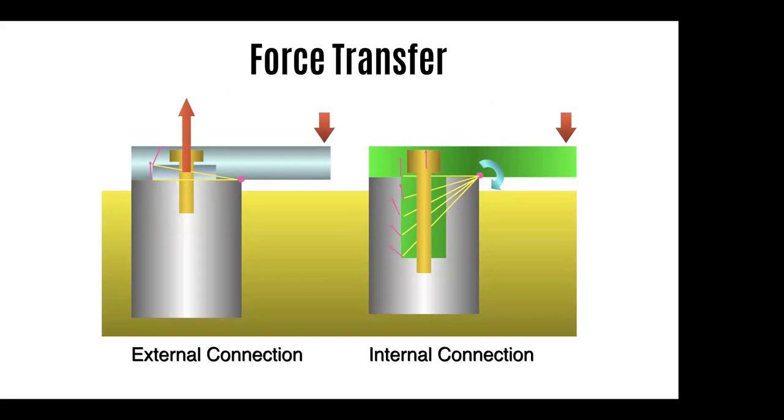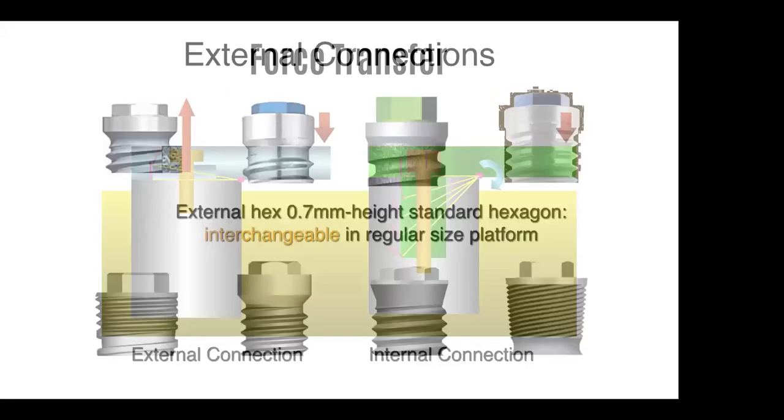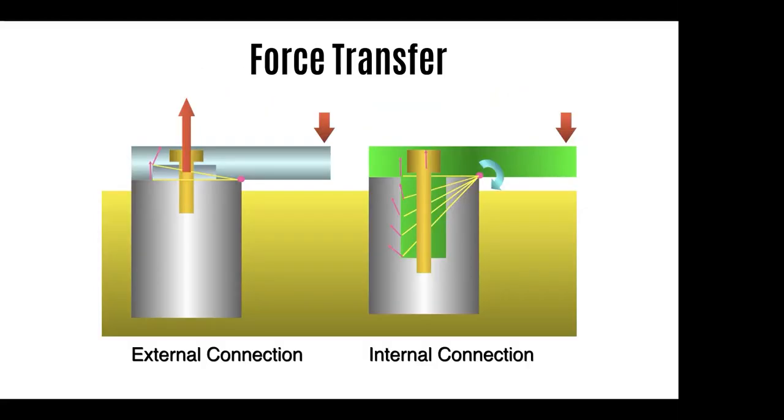On the left, the fulcrum point is at the end of the platform, as you can see in the pink dot. That's the fulcrum point. And there's pretty much this very short wall trying to resist against the lever movement with external connection.